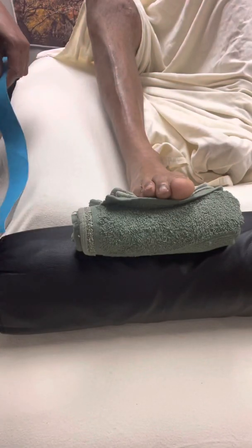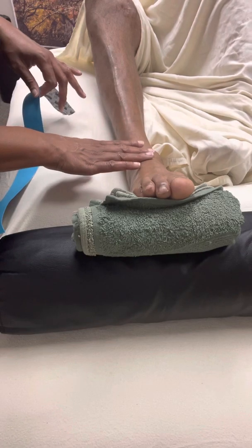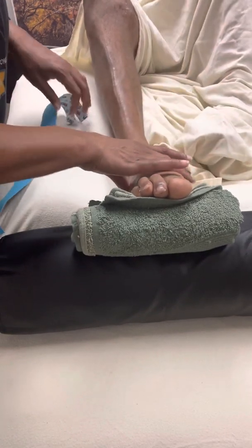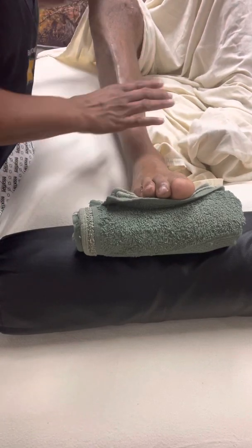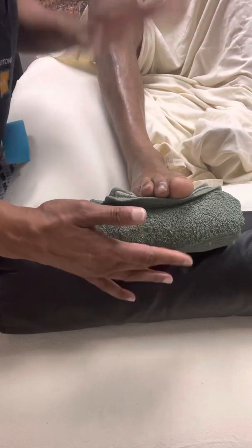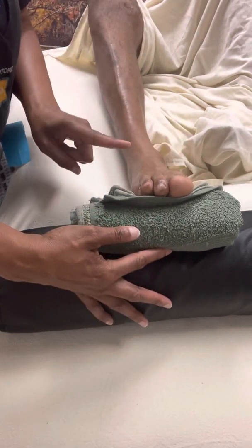Hey, Demetri Davenport here, the massage doctor. Today I have my client here coming in for a taping because he has drop foot. So I have his leg in a flexed position, and I put a towel along with the bolster to have his foot in dorsiflexion.